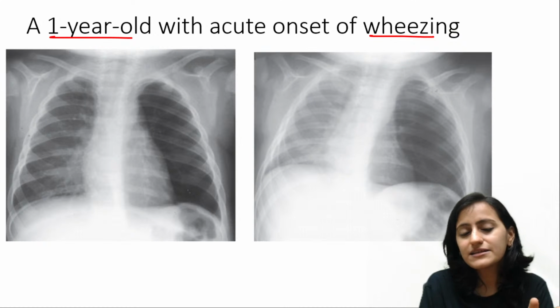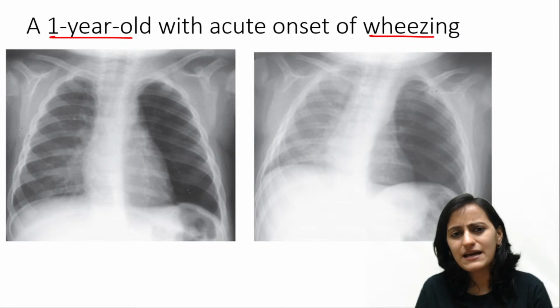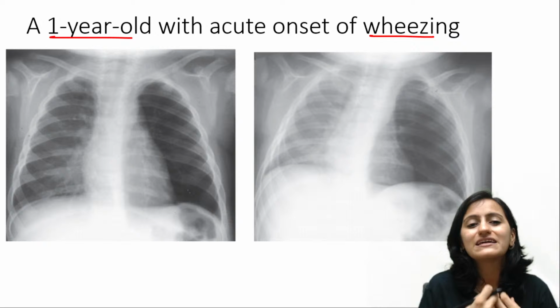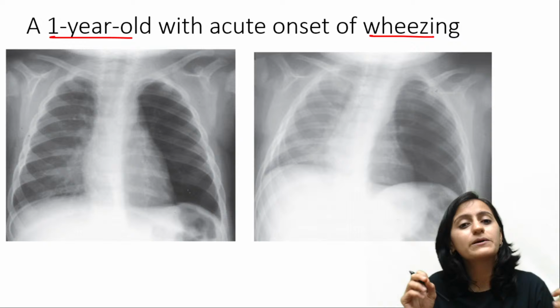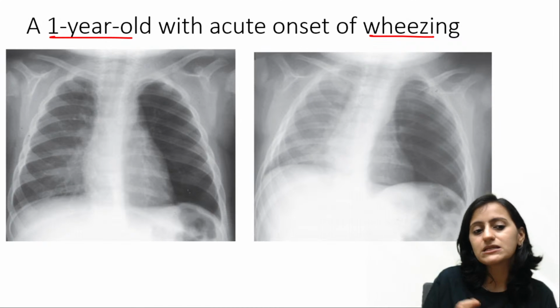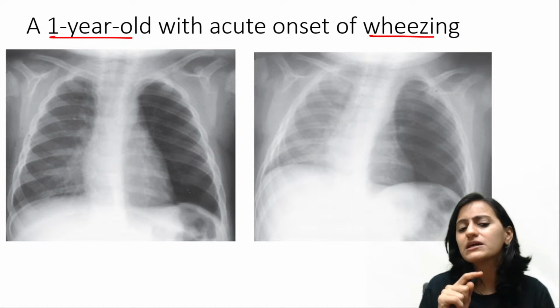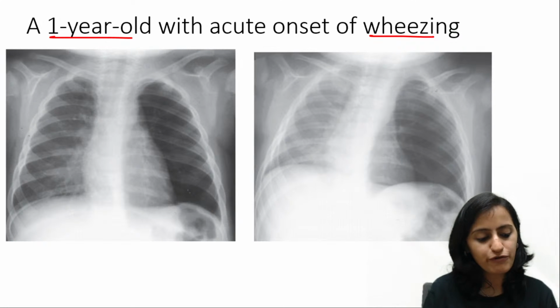In many cases, it is not always necessary that there will be very acute breathlessness. We have seen 1-2 cases in the pediatric age group where the foreign body went unnoticed and was discovered after some time. The patient might have recurrent pneumonias and all of that. Even in your x-rays, you will not always be able to pick them up. If your radiographs are normal but the clinical suspicion is high, be it on x-ray or CT scan, it's always better to go ahead and do a bronchoscopy and rule out your foreign body.